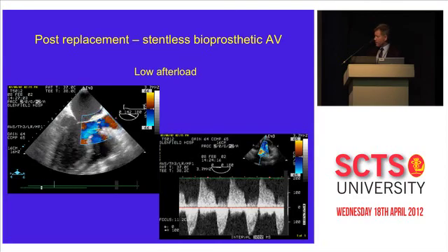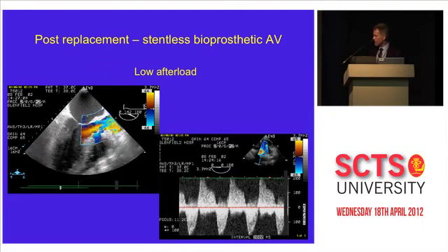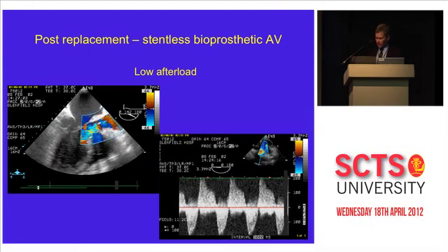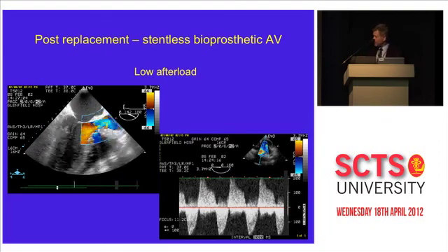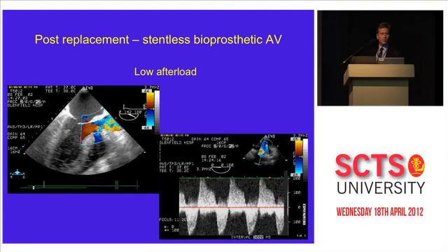And then with your long axis, every second or third beat, that leaflet does not close. And just an indication that we're on a balloon pump here is that there is no ECG connected. And the reason is that we saw this, that every second or third beat, as the heart fills and the peripheral vascular resistance changed, there would or would not be aortic regurgitation.